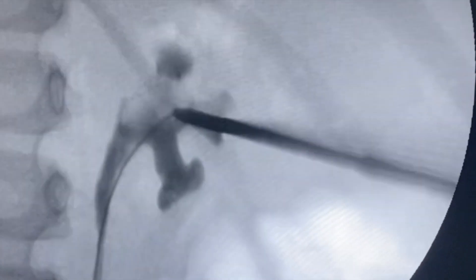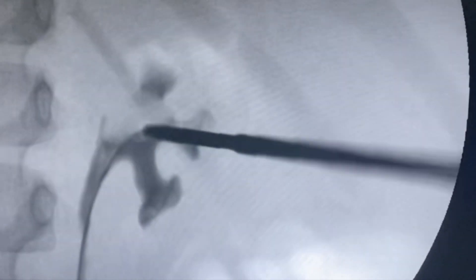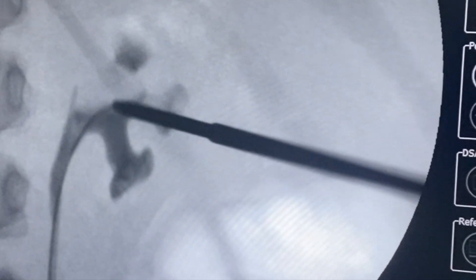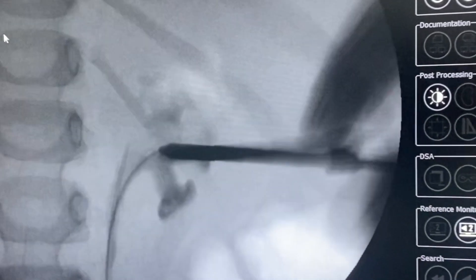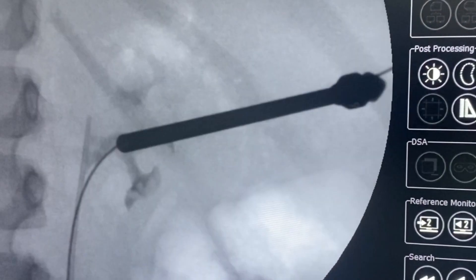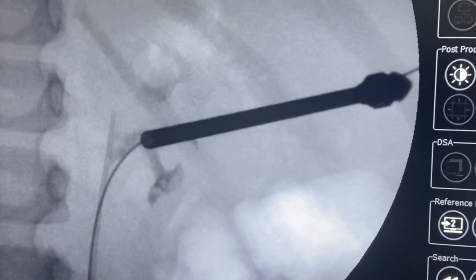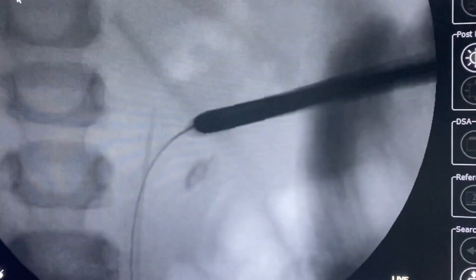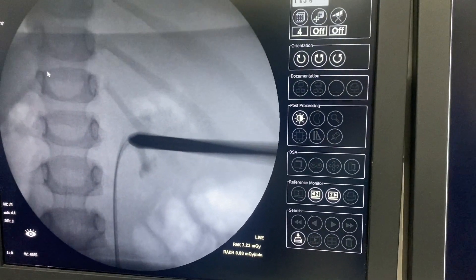Now I am dilating the track using the Alkans cannula, making sure the tip of the cannula is just lying in the pelvis. You should avoid the cannula going too far medially as it might injure the pelvis. The outer cannula is then screwed into position in the pelvis, followed by advancing the single-step dilator into the pelvis using a rotatory movement.